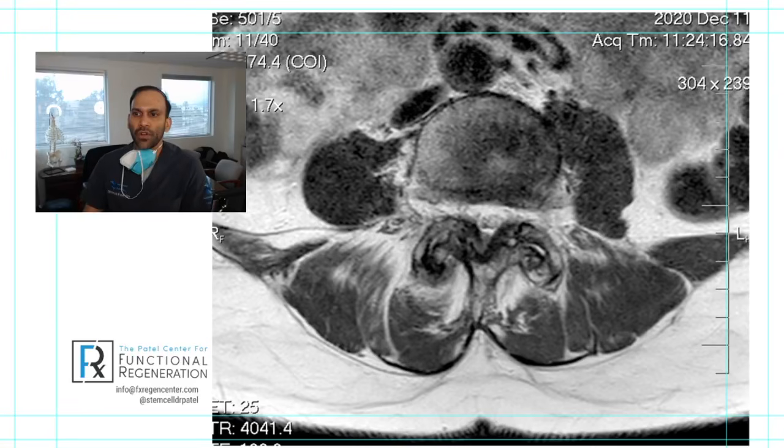Currently, although in laboratory type settings, there are machines up to 9T or maybe even more at this point, I don't know. There's a lot of machines that go down to even 0.3T. I like to get 3T MRIs, but there's a variety out there.